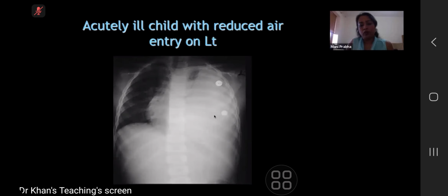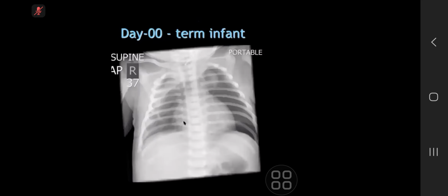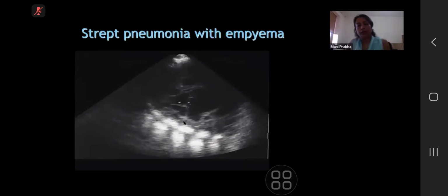And what do we see on ultrasound scan in a case of empyema? I've seen a simple effusion on an ultrasound, but I guess it would be much thicker, more dense appearing. Yeah. It is a loculated collection. That's what clinicians usually ask us to look for.